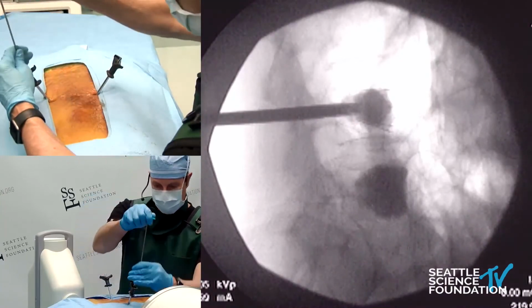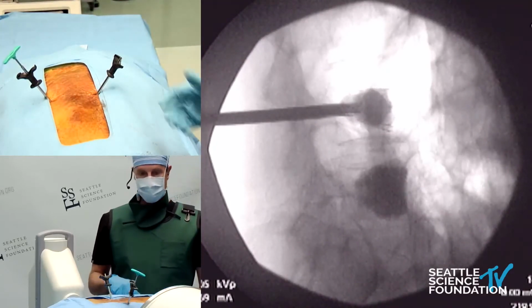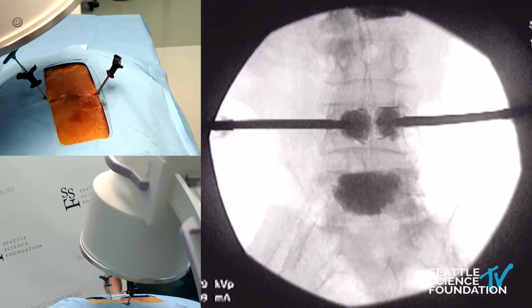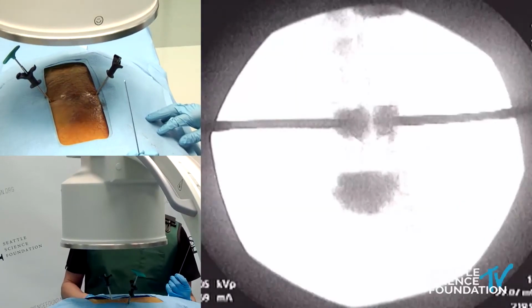Jack is a titanium alloy. It can be used to support the vertebral body. And so we'll take one final AP shot, and then I'll show you how to remove these. In general, the best way to remove these is with a twist. So cement is very resistant to compression.